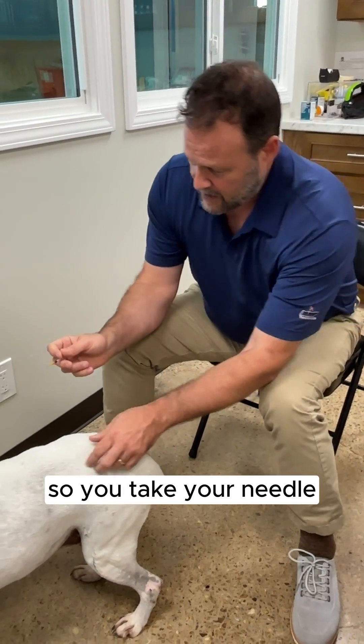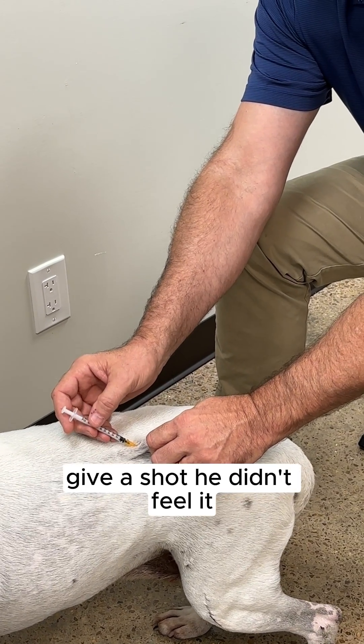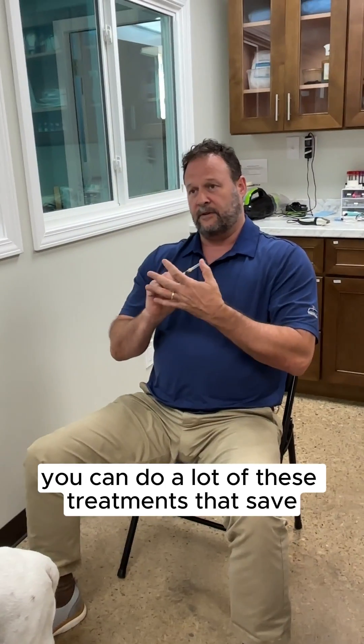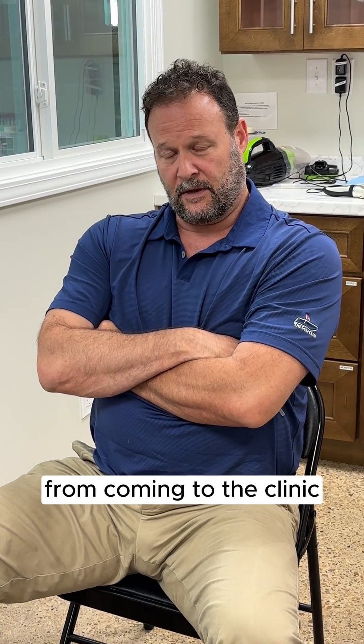So you take your needle, you pick your skin up right here, just like that, and then you just poke it right in there. Give the shot, pull it out — it's no big deal. It makes it easier on yourself, and you can do a lot of these treatments that save you a lot of time and save your pet a lot of anxiety from coming in to the clinic.